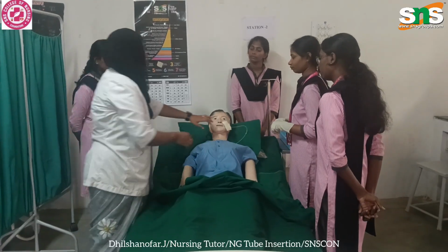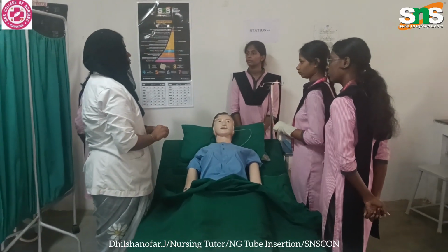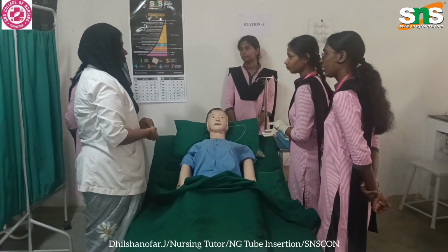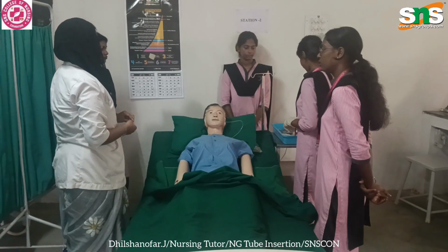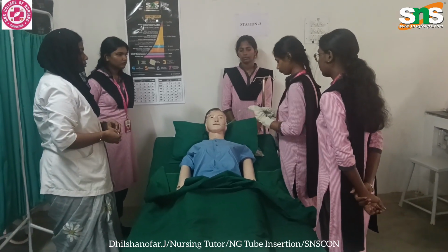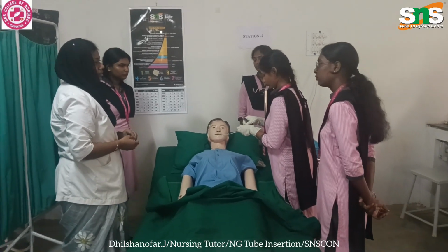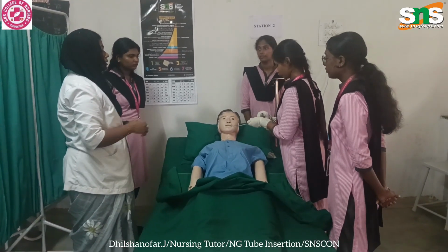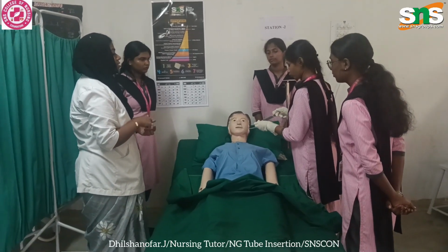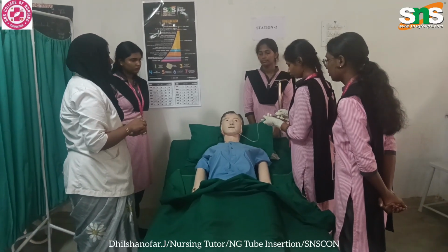After inserting, how will you assess whether it is placed in position or not? Two methods are there. First method is the aspiration method. We have to insert a syringe and aspirate. If gastric content is coming, it is in the correct position.